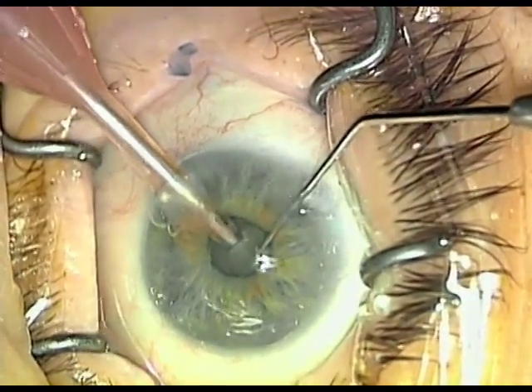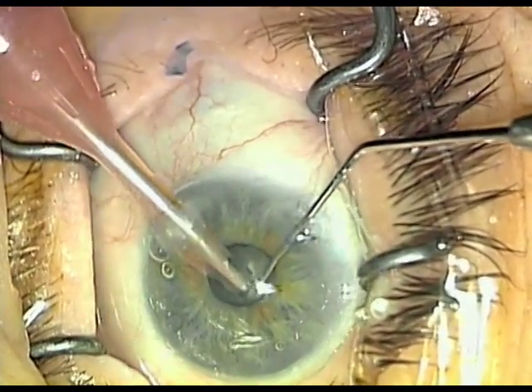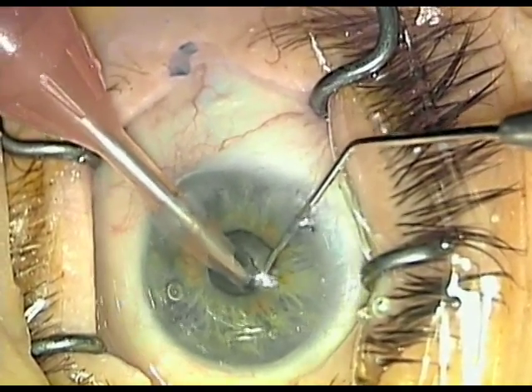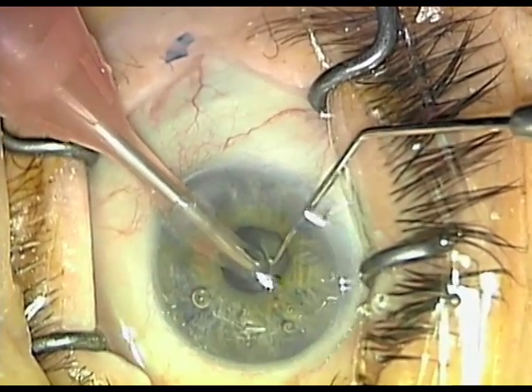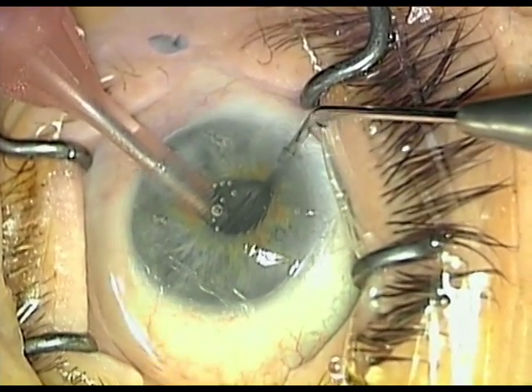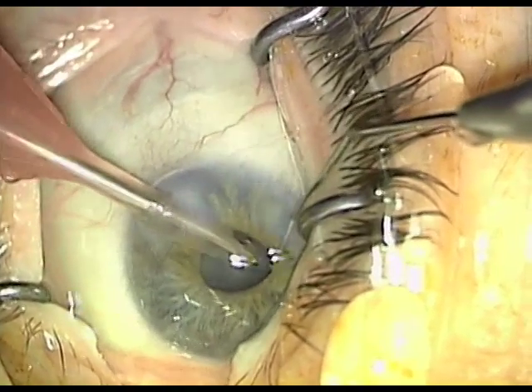It's an advantage not to stretch the pupil in cases of very floppy irises, and also in cases where there is uveitis, and even in a phacotrabeculectomy where you don't want to have bleeding in the postoperative period or an excessive breakdown of the blood aqueous barrier. This technique is a huge advantage but requires two conditions in order to be able to do this with a small pupil technique.